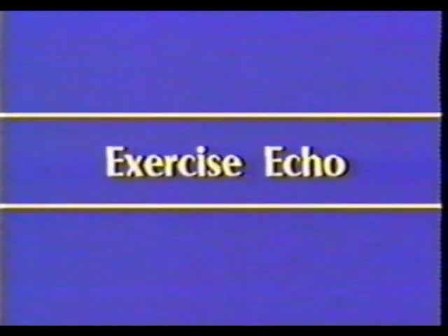Exercise echo, like exercise radionuclide testing, is used to enhance the diagnostic accuracy of the standard exercise ECG. Using supine or upright bicycle exercise, echocardiography can be performed at intervals during exercise. We prefer to use standard treadmill exercise testing, with echocardiography performed immediately after exercise.